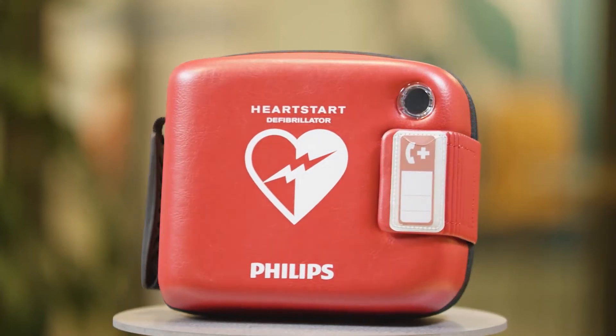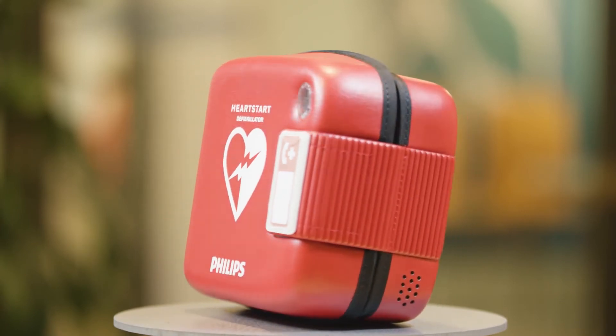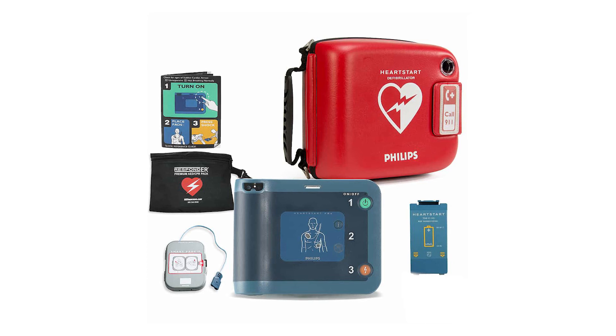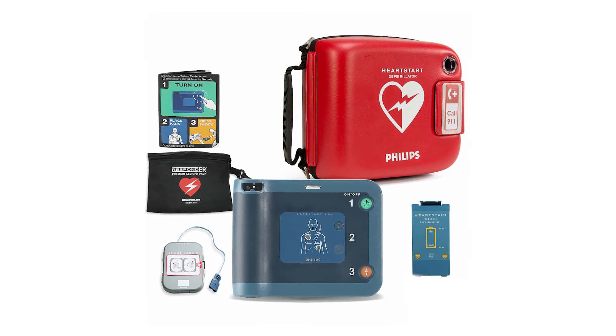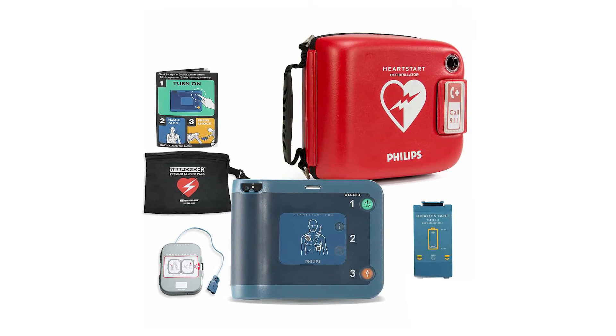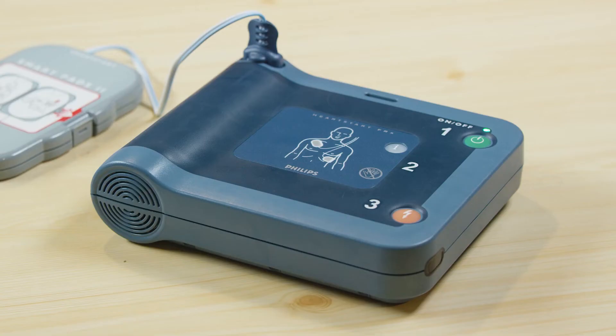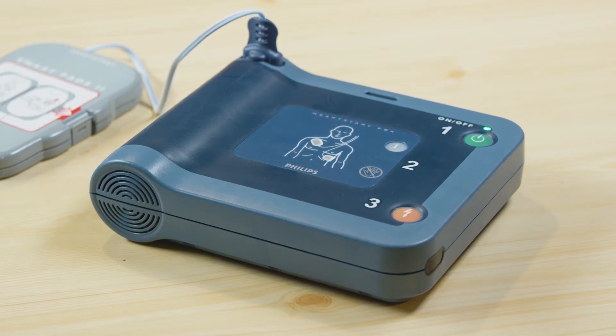Philips is the industry leader in AED devices, and the HeartStart FRX is specifically designed for first responders with CPR training, such as police and firefighting personnel. The package includes the HeartStart FRX device, battery, one package of smart pads, the owner's manual, and a quick reference guide. The HeartStart FRX performs a daily self-check to ensure all systems are operating properly — no manual calibration is required. As long as the green ready light is blinking, the device is ready for use.